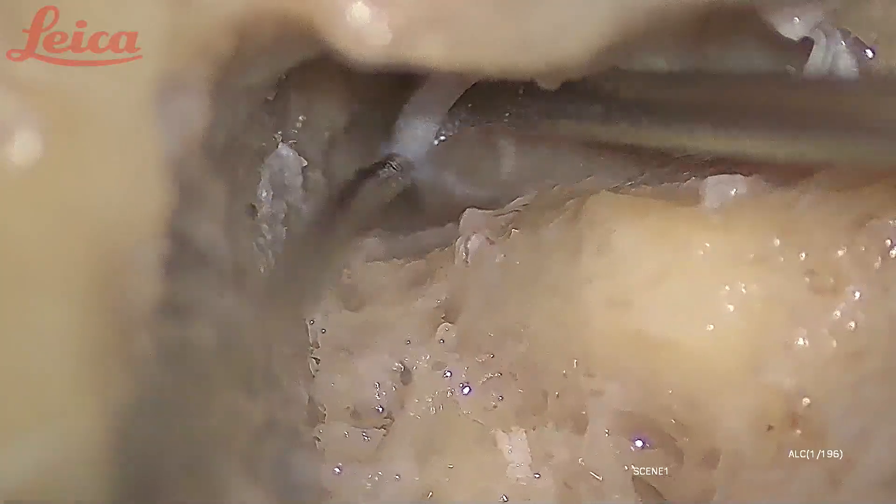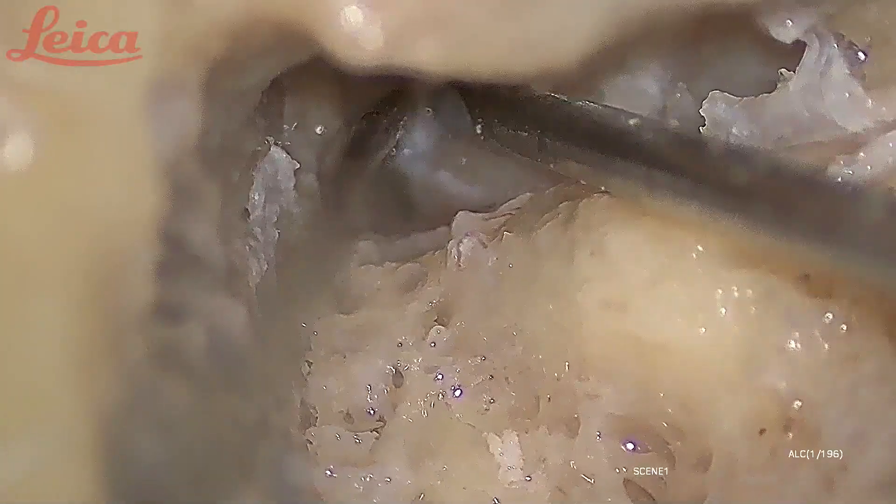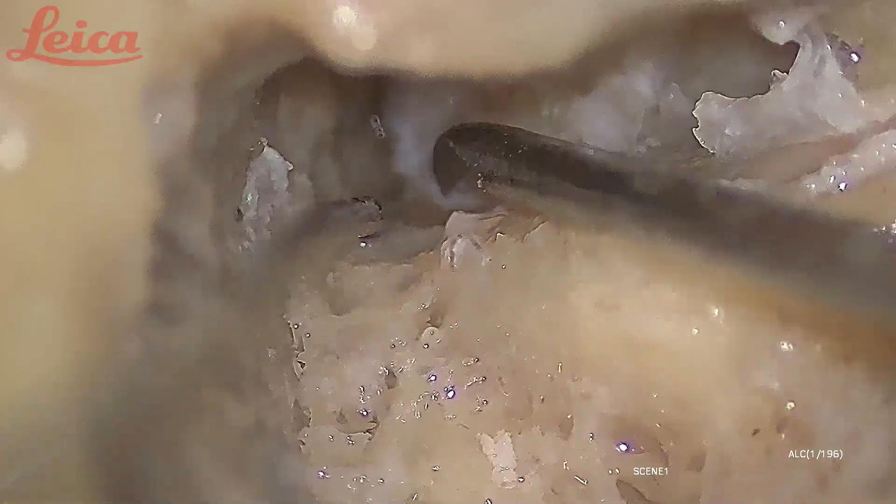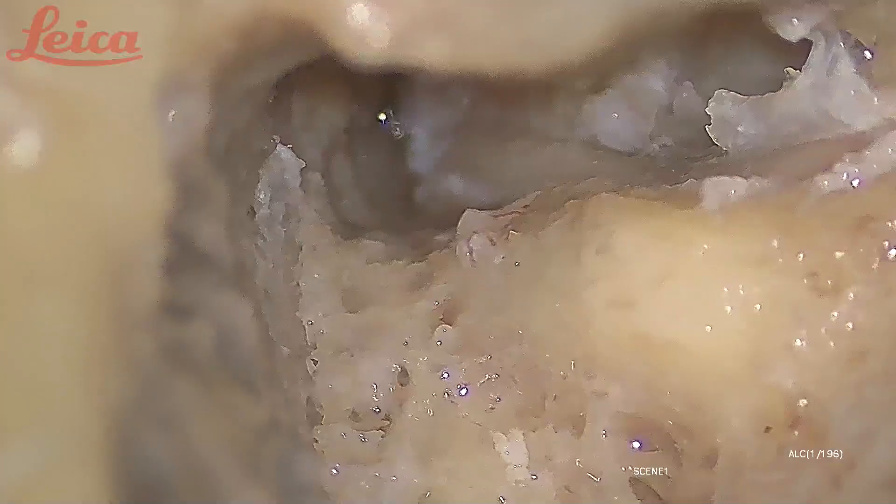Here you can see that the sheath became very thin when I moved towards the first genu. Now I am happy with the decompression — you can see the very healthy-looking perineurium.